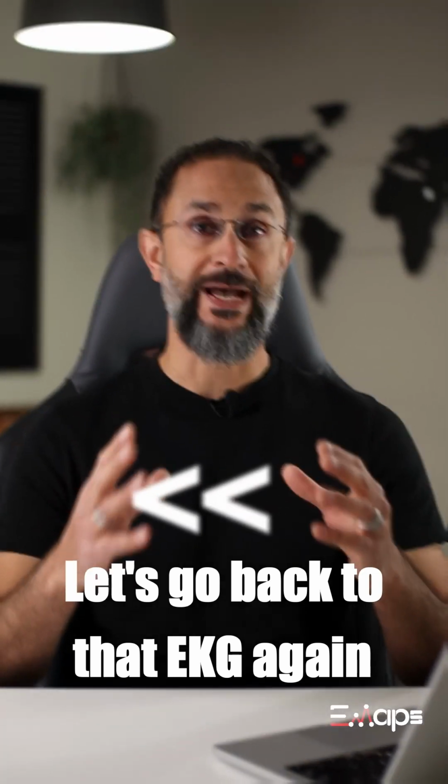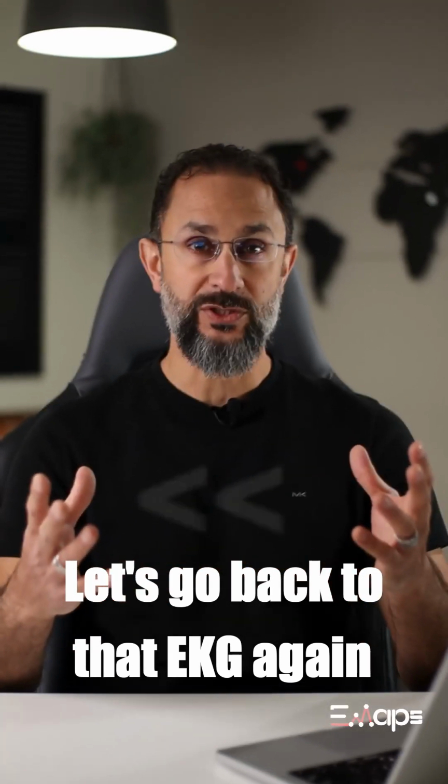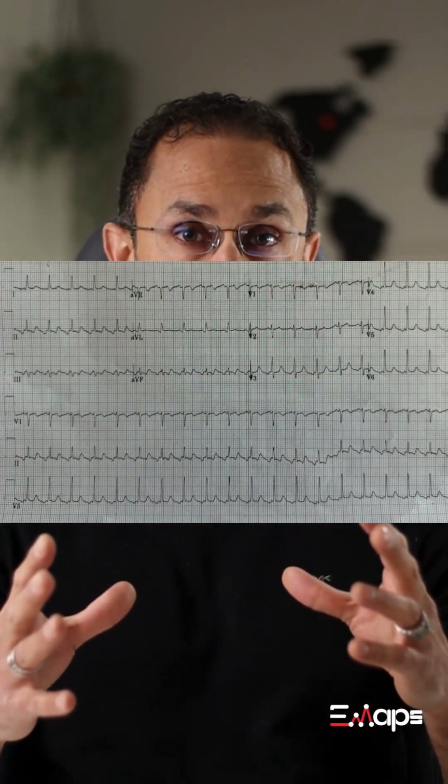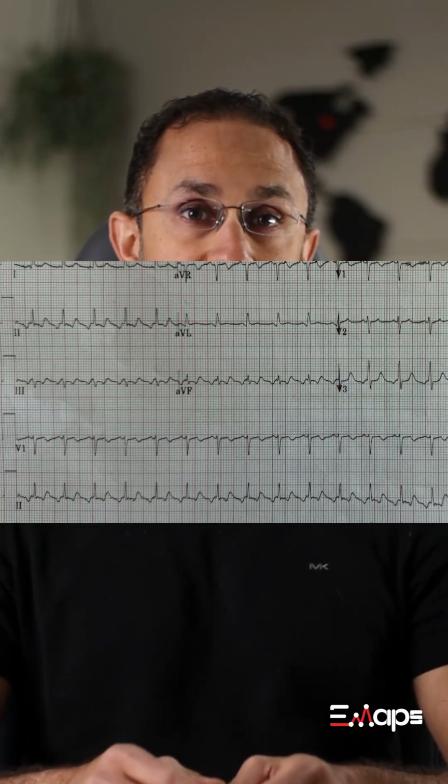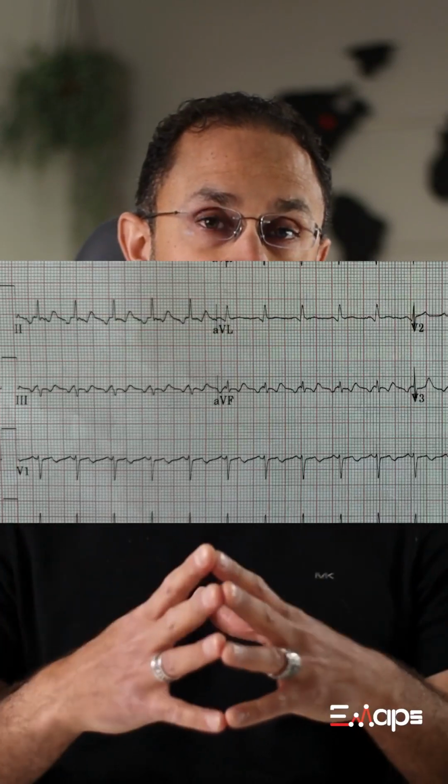You might be tempted to perhaps discharge the patient because you haven't really identified anything abnormal that would explain his tachycardia. But you're bothered that this is sinus tachycardia and you haven't really found a reason for it. And you ask yourself, what am I missing here? You look at the EKG and you see that there are P waves before each QRS complex. You also notice that the EKG overall appears to have a sawtooth-like pattern to it. So you're thinking, could this be atrial flutter?